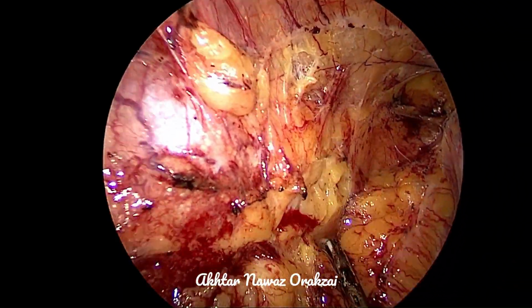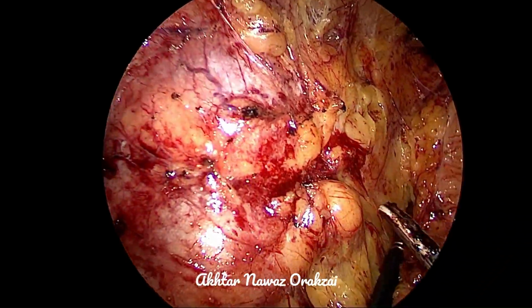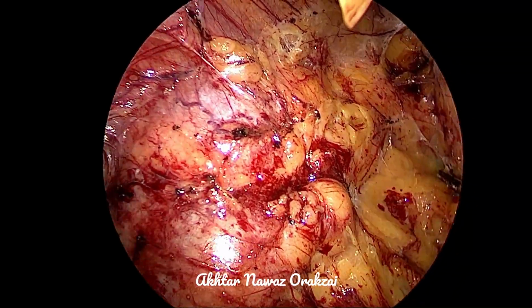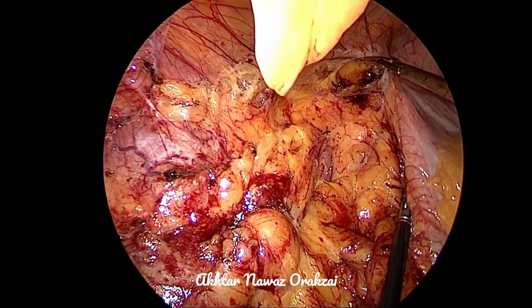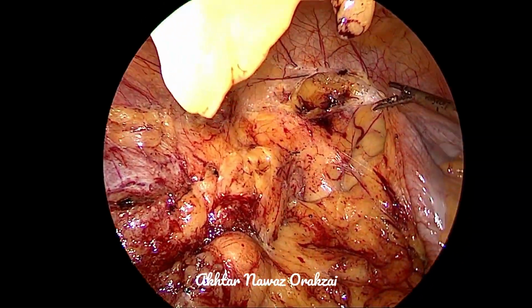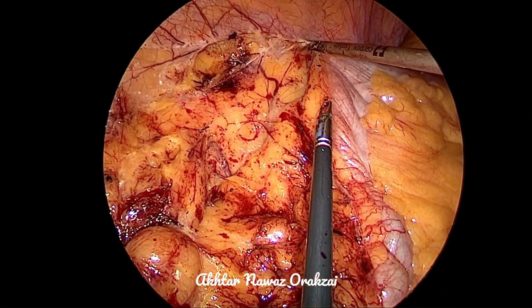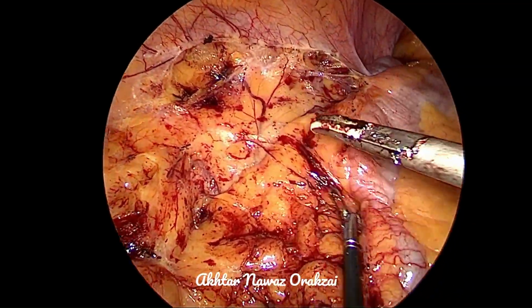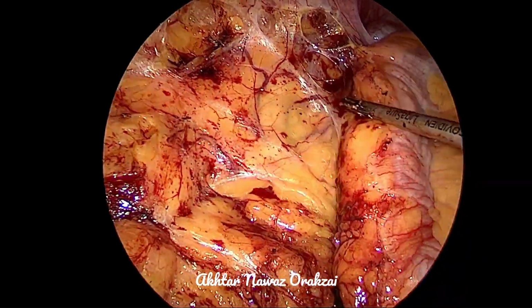Here you can see that we have mobilized the upper portion quite a bit, and now after mobilizing a little bit of the upper pole, we are coming lower down. We are trying to identify the ureter in the area where there is not much inflammation. However, as I said, there were many episodes of pyelonephritis, so the kidney is chronically pyelonephritic.